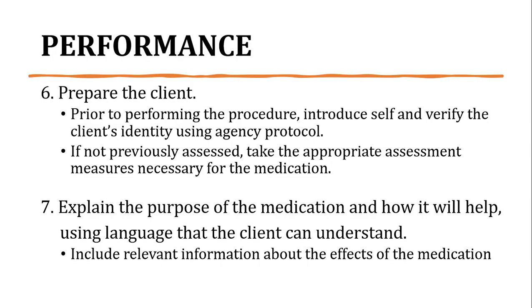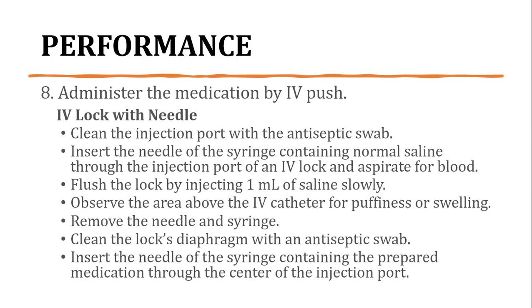Ginagawa po siya, in-explain yung purpose ng medication and paano siya makakatulong sa client para po ma-encourage din po siya and magkaroon ng client participation in the procedure para po maiwasan din yung pag-ayaw ng client sa pag-administer ng medication. Then, administer the medication by IV push. The first variation is IV lock with needle.